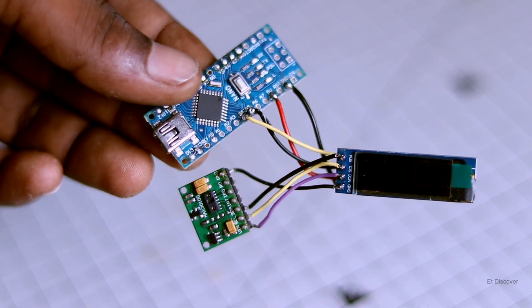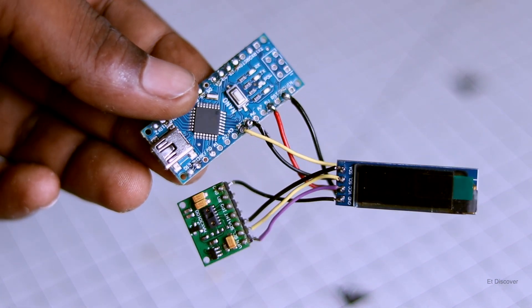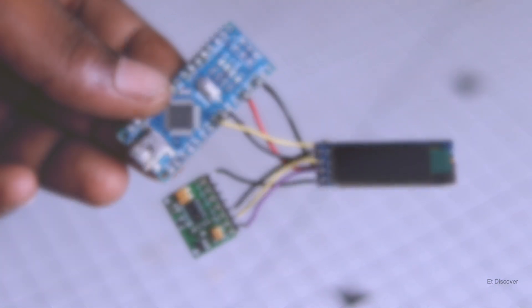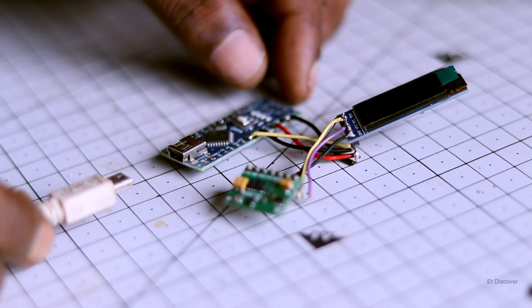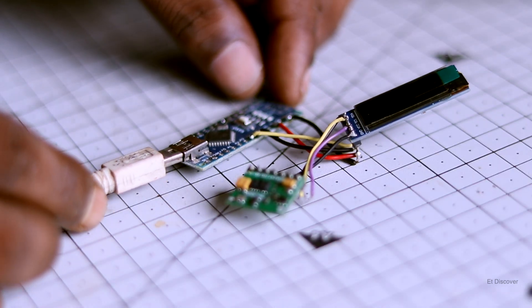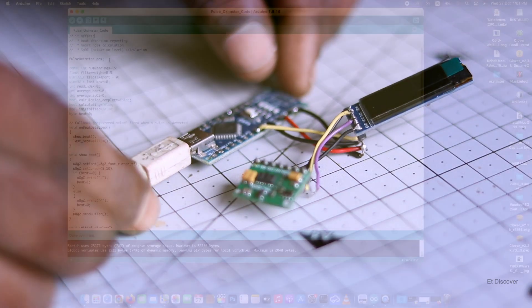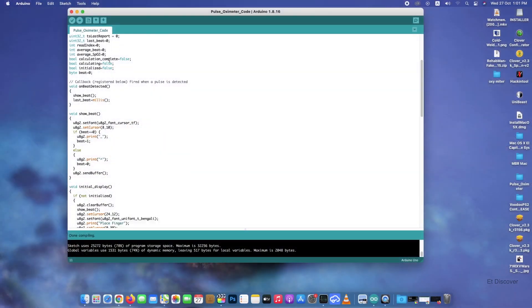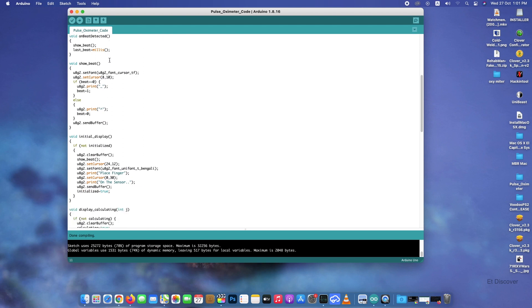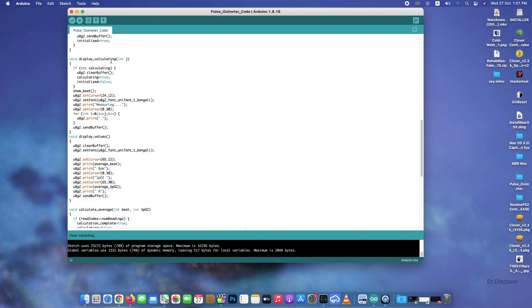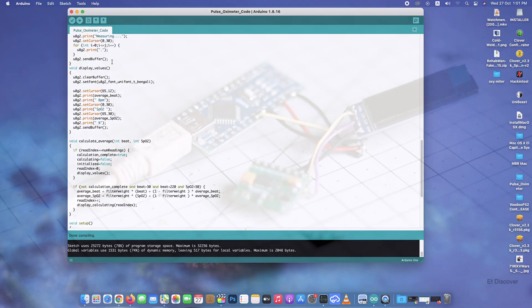Everything is connected very well. Now it's time to upload the program for Arduino. So that is why I connect my USB cable to this Arduino. And here you can see, this is my code. So I upload this code in my Arduino Nano.